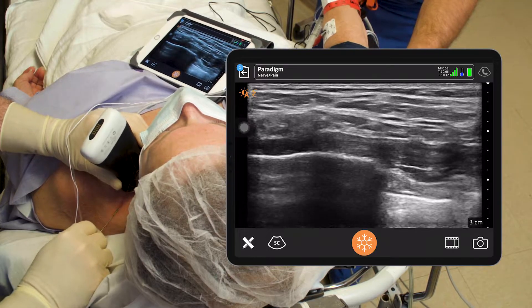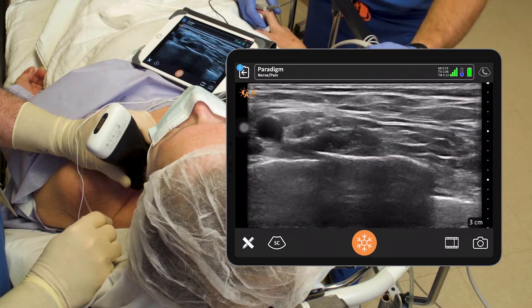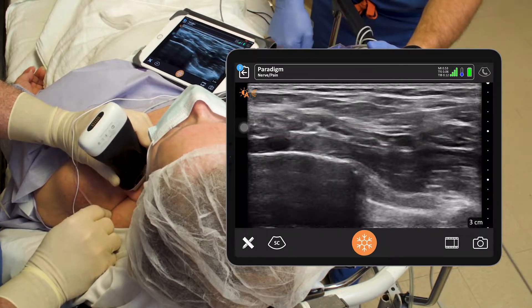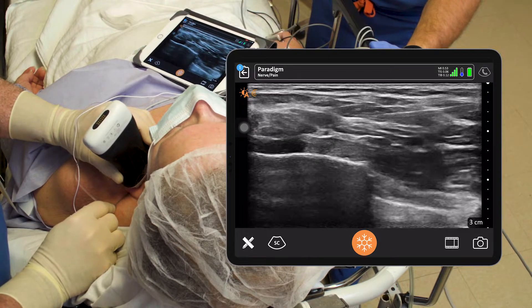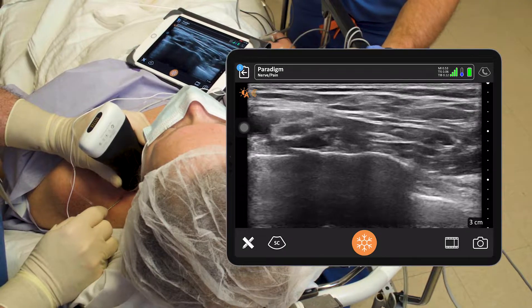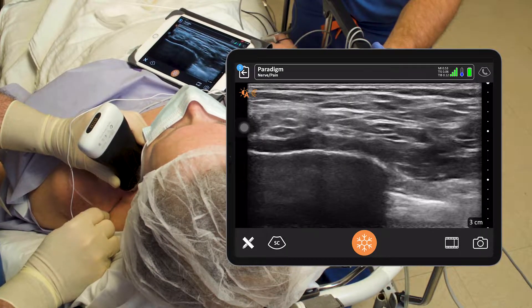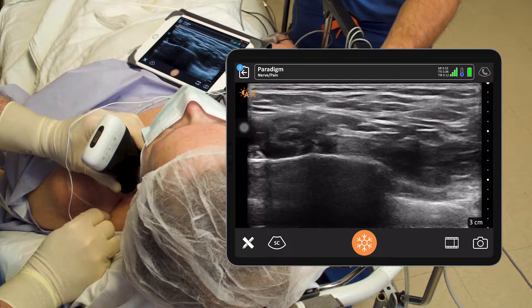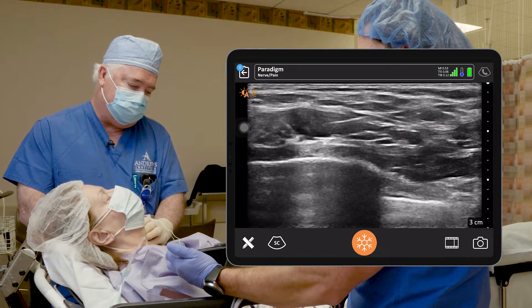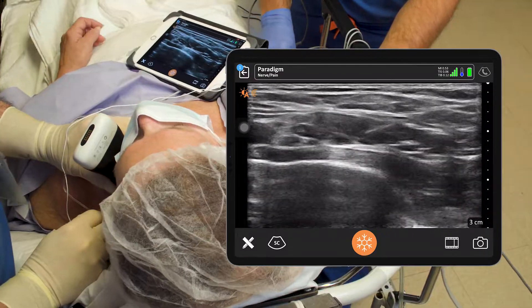Now I want to come up a little higher and try to separate the other trunks. Coming in more up here — we've got our corner pocket good. We're getting a twitch there. Kind of hard here. Sometimes you can peel off the upper trunk really easy, but this one's not going to be so easy. Getting some twitches there. Rocky, give us five right there and let's see what we can open up. All right, so we opened up a little bit.